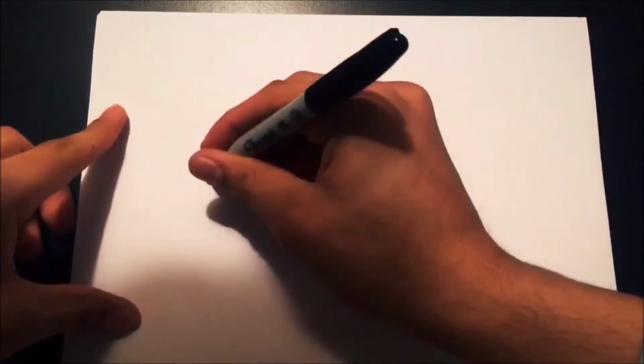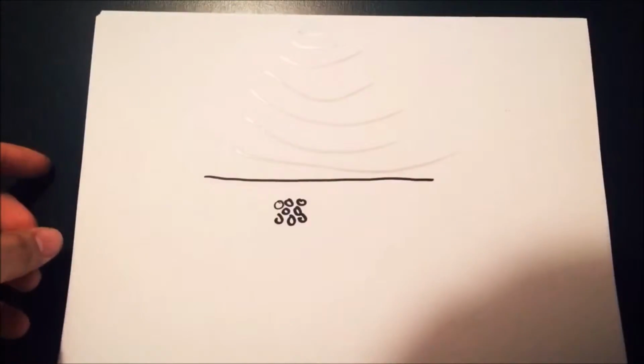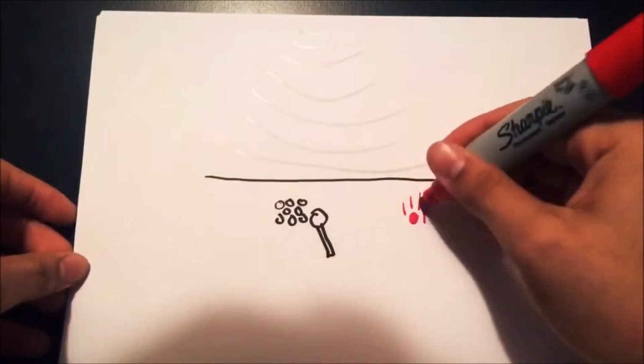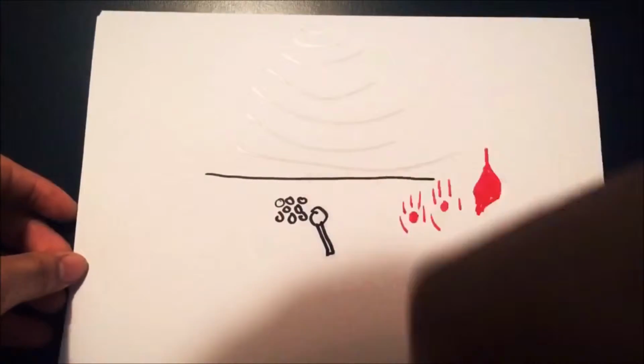So what's that? The waves traveling and being transmitted through the tissue will cause vibrations on a molecular level. So all these tightly packed molecules you're made up of will begin to move around due to the vibrations and begin to crash into one another. At a high enough intensity, these collisions will produce heat.